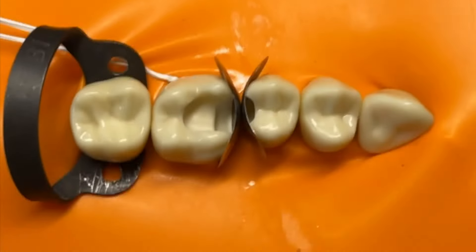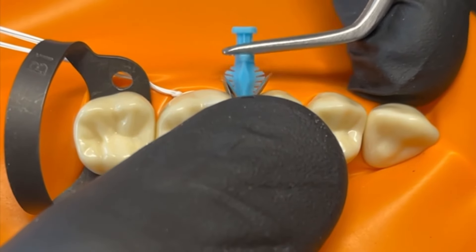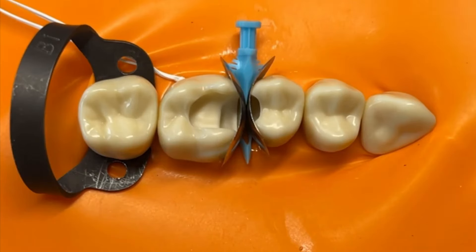It's really important that these matrix bands actually touch the way you want at this point, and if they don't, we need to get more curved bands or change their profile. Once they're in place, you can place a wedge as long as it doesn't create distortion of those bands. You don't absolutely have to use a wedge, as I'll show in a minute, but you can certainly place one here if it's working well.